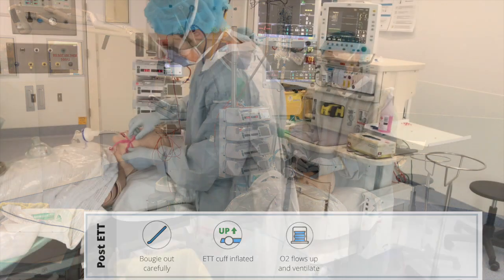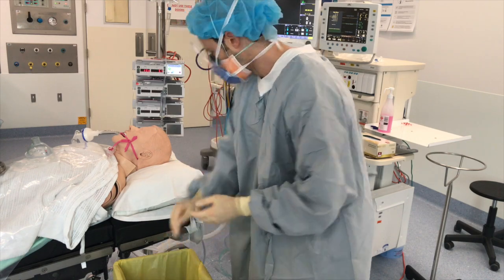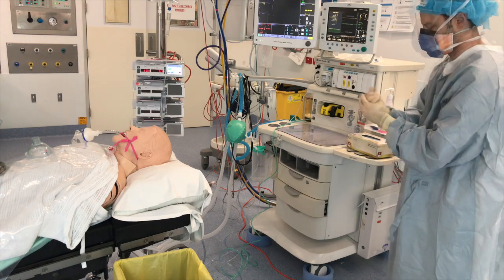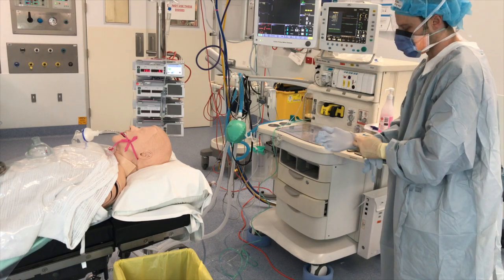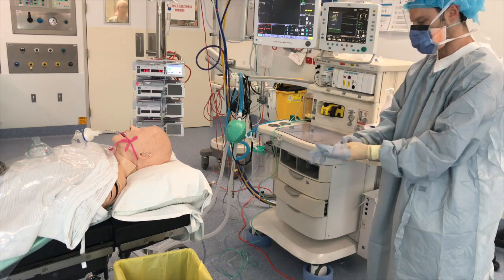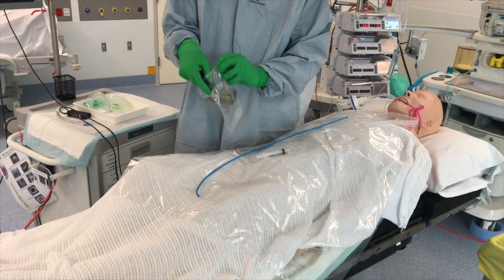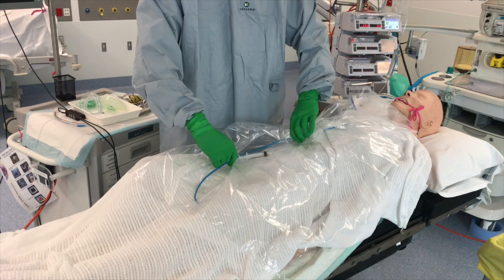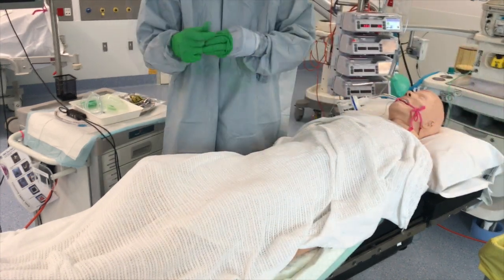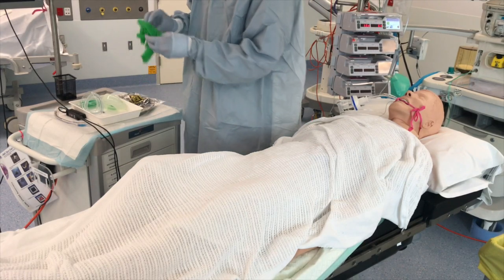After the tube is secured, the airway operator should remove their top pair of gloves, sanitize the bottom gloves, and then reapply a second pair of gloves. The procedure should be repeated every time a patient or the machine or circuit is touched. At the same time, the CMAC blade should be bagged, and any waste materials should be wrapped and discarded immediately. The top pair of gloves again should be removed, the bottom pair sanitized, and a second pair reapplied.